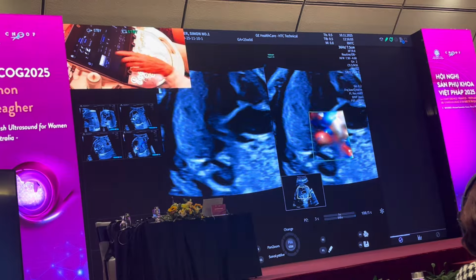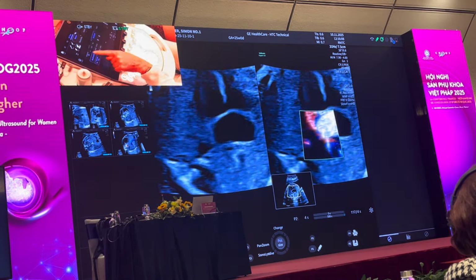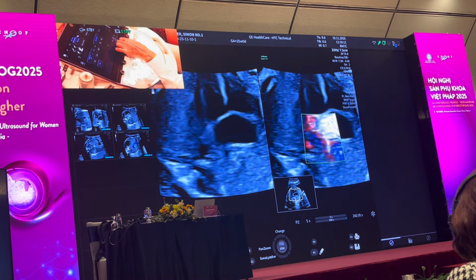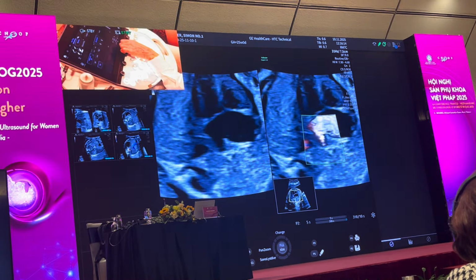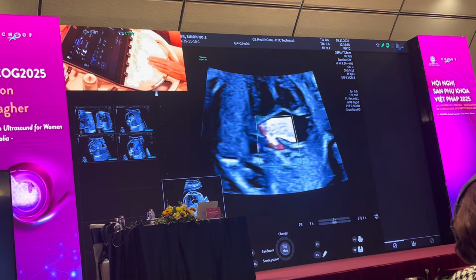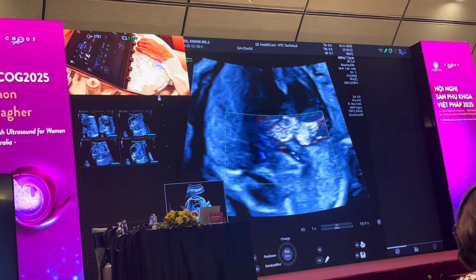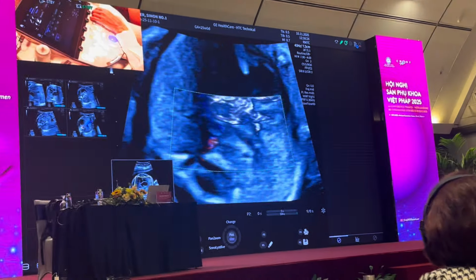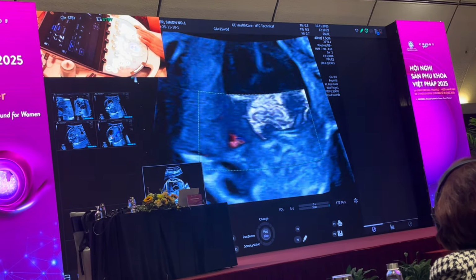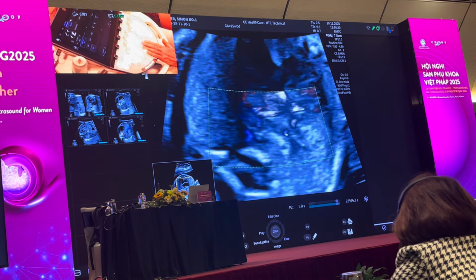The other way is to look at slow flow. When you look at slow flow, you need to turn the background on, and with this you reduce your balance. And when you reduce your balance, you can see the pulmonary veins coming very nicely. Put this in here, magnify the image, zoom it up, and you can now see the pulmonary veins entering into the left atrium. This is why I like slow flow, because it gives you precision in seeing these tiny little vessels, and that's why I like it also.